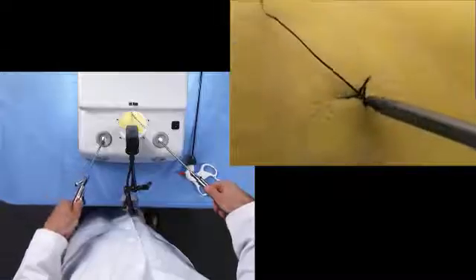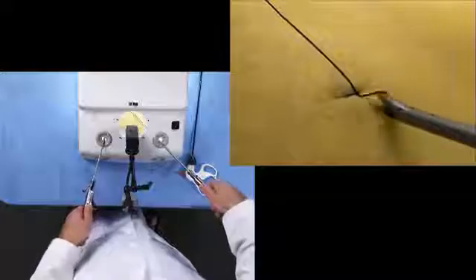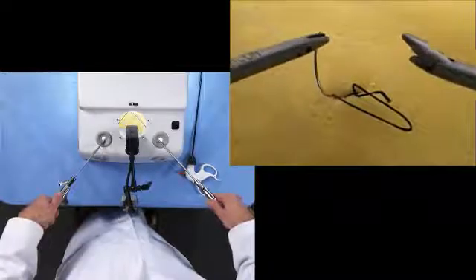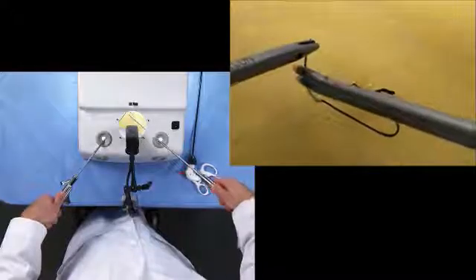The left hand then goes to 11 o'clock, while the right hand goes to 5 o'clock. Release the tag, bring the needle back. The tag is now to the right of the knot. The needle is to the left.